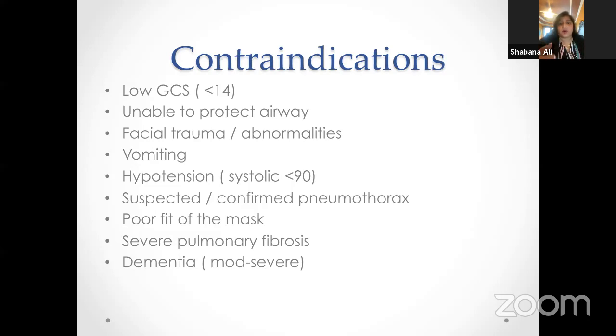Vomiting: if the patient is going to vomit and you have the mask on, they are going to aspirate everything into the lungs, which may cause pneumonia. So this is not a good option for the patient. Hypotension: as we mentioned, CPAP affects the preload and afterload of the heart, and it may reduce the blood pressure. So if the patient already has a systolic pressure of less than 90, it will decrease the pressure further. So this is not a good option if the patient is hypotensive.